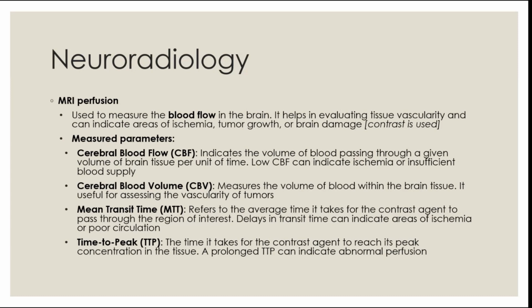the mean transit time, which is the average time taken for the contrast to pass through the region that you are studying, and time to peak, which is the time taken for the contrast to reach its peak concentration in the tissue. So any delay in the mean transit time means that there is poor circulation, a decrease in the blood flow to that region. And if the time to peak is prolonged, this means that there is some abnormal perfusion in that region.